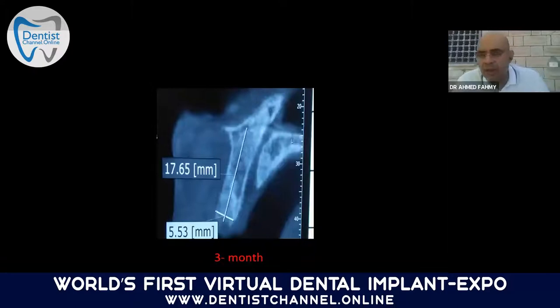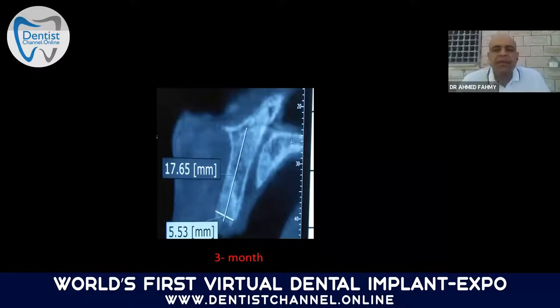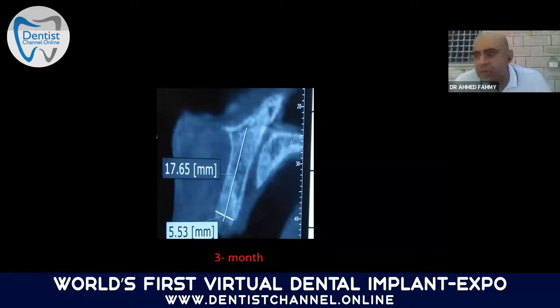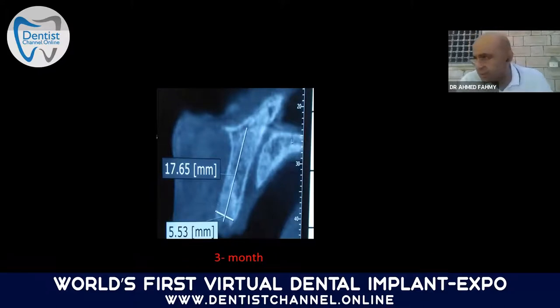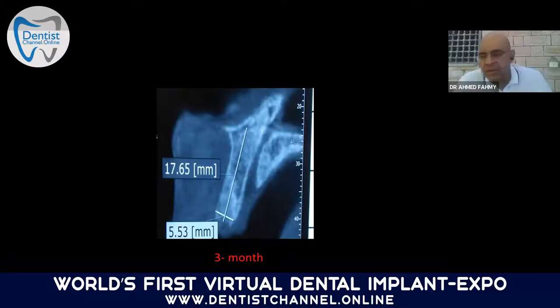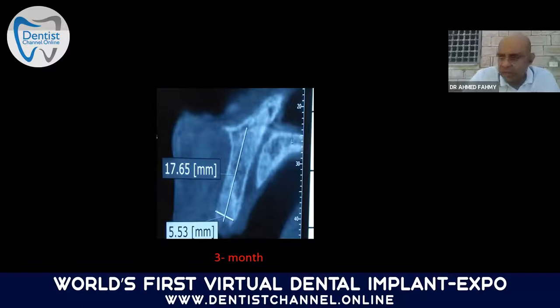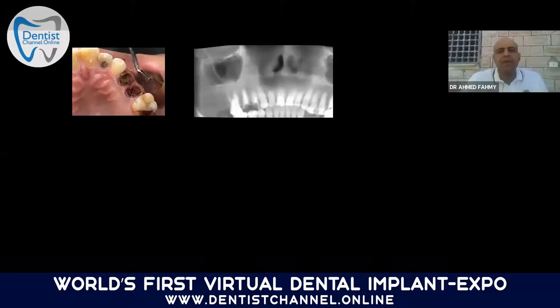After three months, the patient returned to our clinic. On CBCT evaluation, the bone diameter measured 5.5 mm in width and 17 mm in height — perfectly suitable for implant placement.